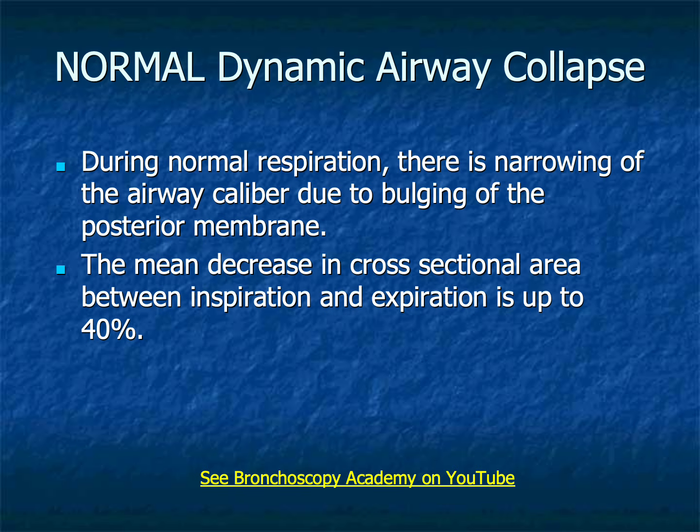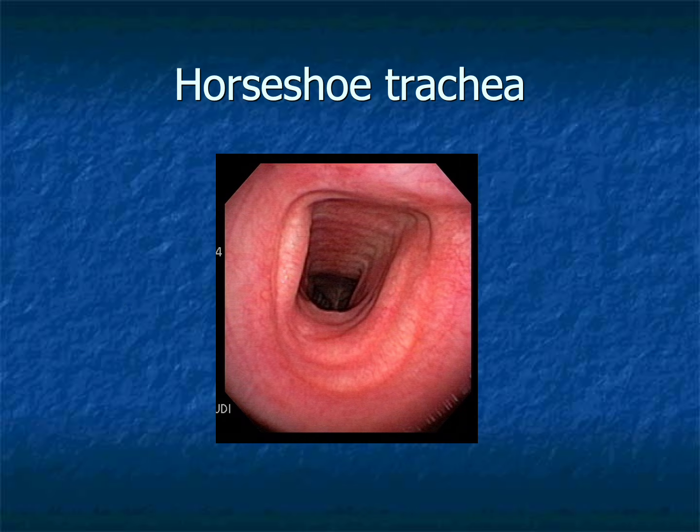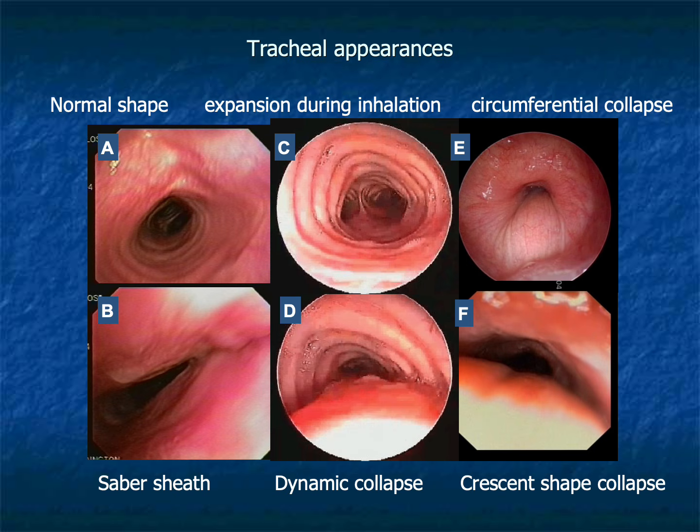This is an important concept for trainees because dynamic movements should not automatically be mistaken for pathology. The airway is alive. It moves continuously. Only through repeated observation does one learn the difference between physiological motion and pathological collapse. These distinctions require experience, judgment, and pattern recognition.